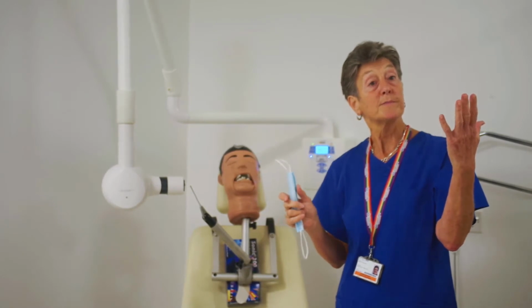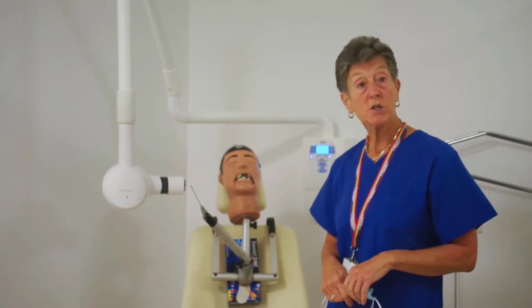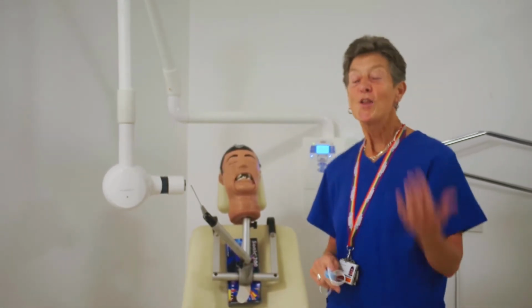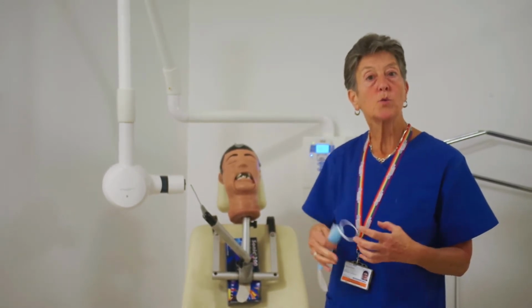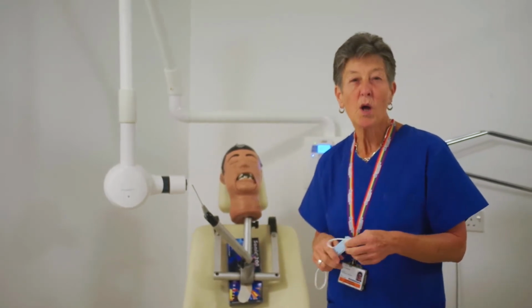Mark? Explanation to the patient. Excellent. It's always a good idea to communicate with your patient and smile at them while you're at it. So explain what you're going to do, explain how it all works. Maybe, it's not going to take too long.